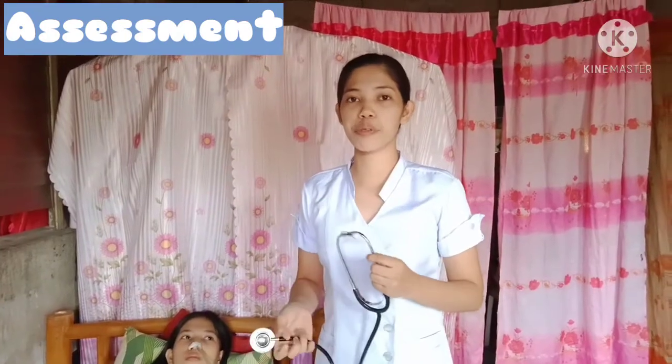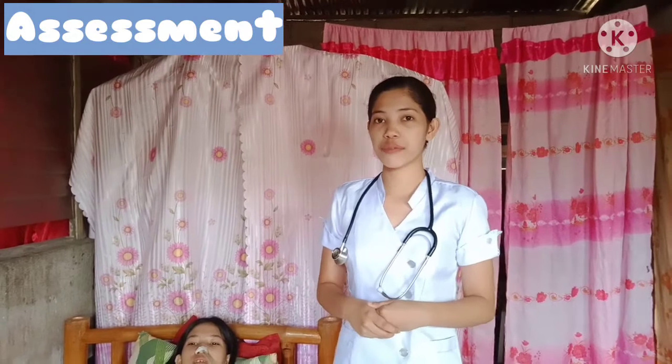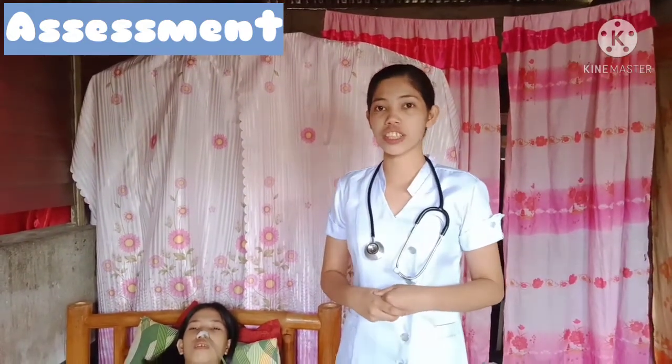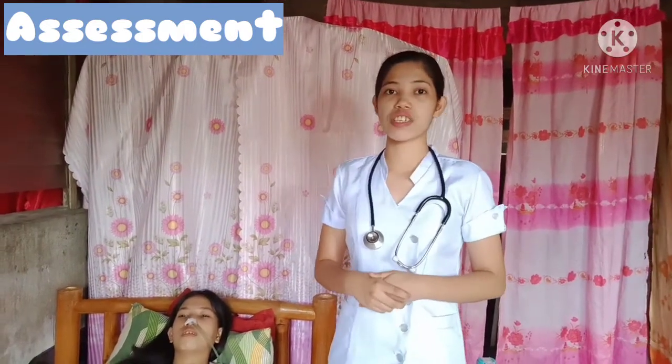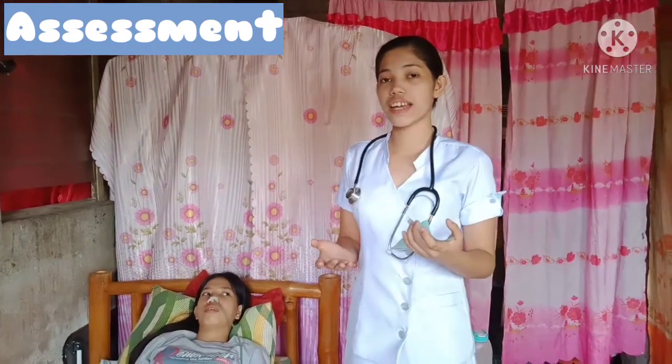Auscultate for bowel sounds before feeding. Absent bowel sounds may indicate decreased ability of the gastrointestinal tract to digest or absorb nutrients. After that, we have to obtain baseline weight and laboratory values, and assess the client for fluid volume deficit or excess, and electrolyte and metabolic abnormalities such as hyperglycemia. So, enteral feeding is to restore the client's nutritional status and provide objective data to measure the effectiveness of feeding.